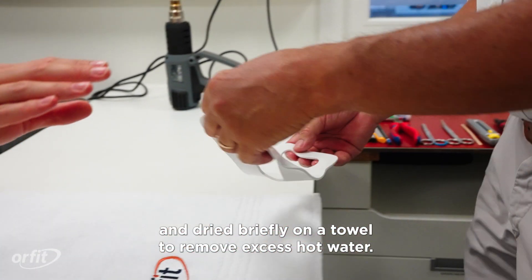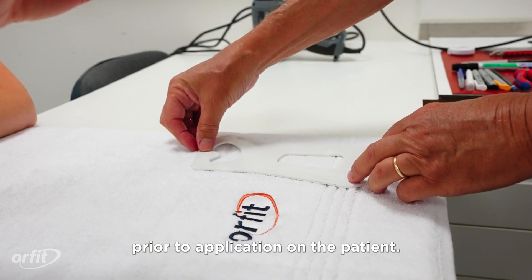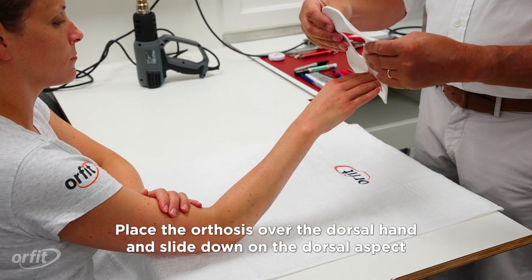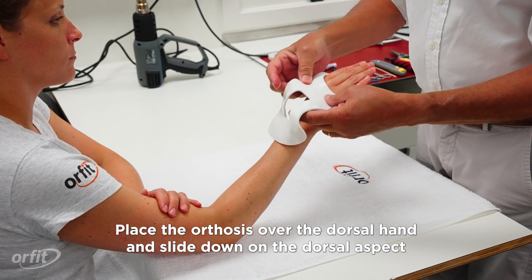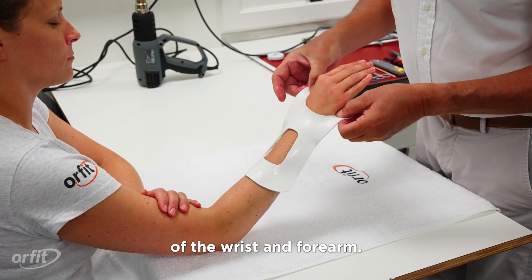The material is removed from the heated water and dried briefly on a towel to remove excess hot water. The temperature of the material should be tested prior to application on the patient.